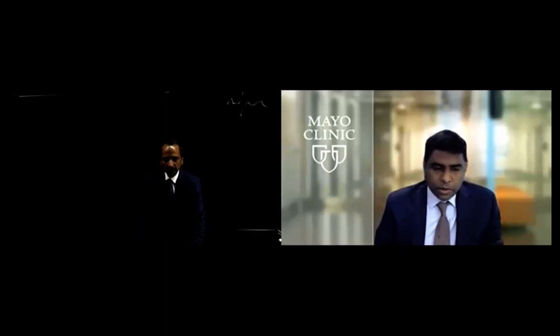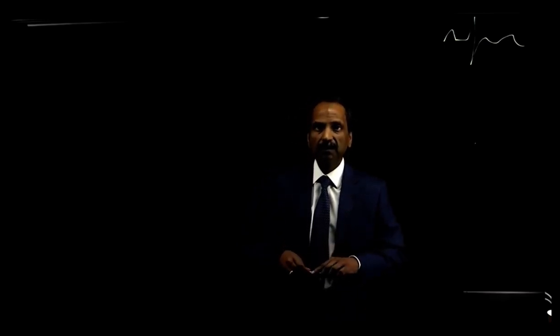Yeah, thank you, Sam. I think there are a couple of questions talking about epicardial connections in difficult to ablate flutter. So the ECG looks like typical flutter, and we do an ablation, but we're still not able to terminate the flutter. Dr. Labu says, is it possible that there are these epicardial connections that we are not really getting to during that ablation? Okay, fair enough. So maybe we'll use that as a segue for left atrial flutter as well.